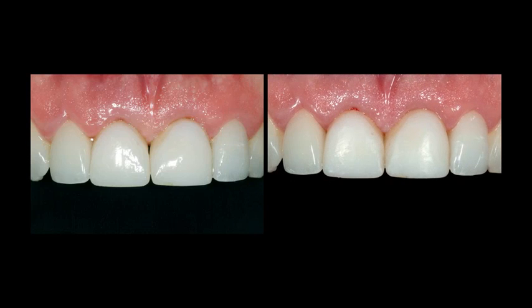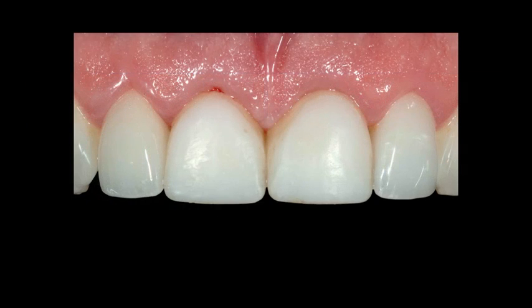And if you look here, once we've finished the contouring, the tissue looks much better, and it has a more triangular appearance. It looks more like what I want the final restorations to look like. Here it is about a month after doing this. I've probed around it to see how the tissue is. There's just a little peak of bleeding there, but for the most part it's nice and healthy and pretty firm looking.